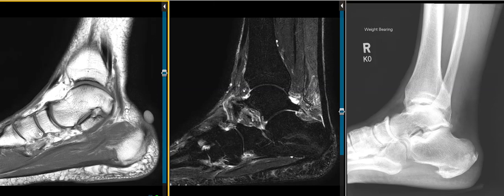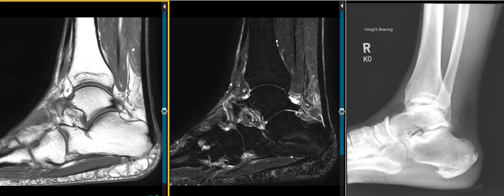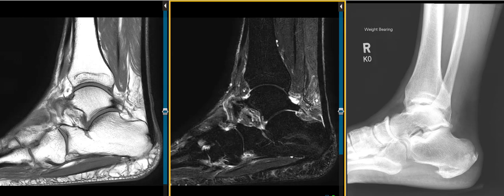There's a fat pad. We'll see it better on this view. Below the muscle, in front of the Achilles tendon, we have a fat pad. It should be bright and uniform, and instead over here it is more heterogeneous rather than low in signal. It's a little bit bright, so there's a little bit of edema in this little fat pad. We call this peritendinitis, inflammation along the anterior margin, the peritenon of the Achilles tendon.